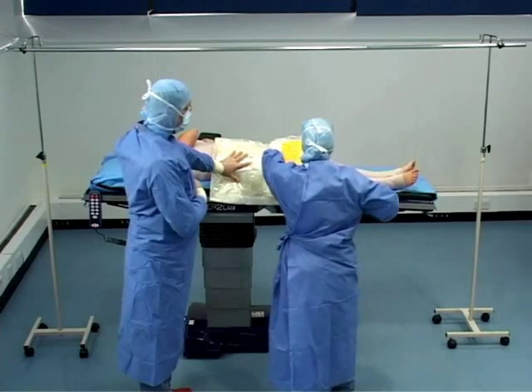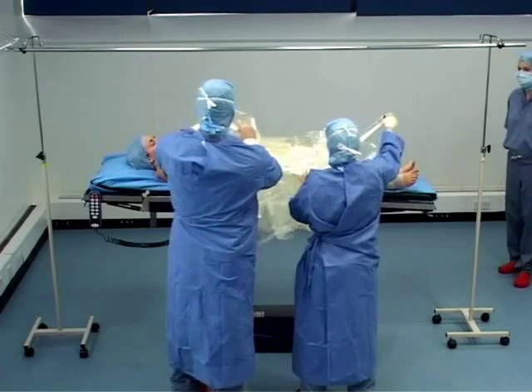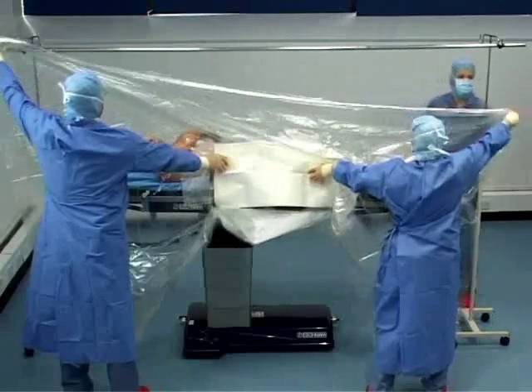The two arrows in the top right and left corners facilitate the correct opening of the drape, and it is then secured into place on the overhead pole with a full width adhesive strip.